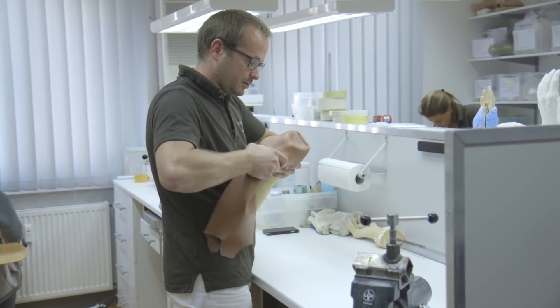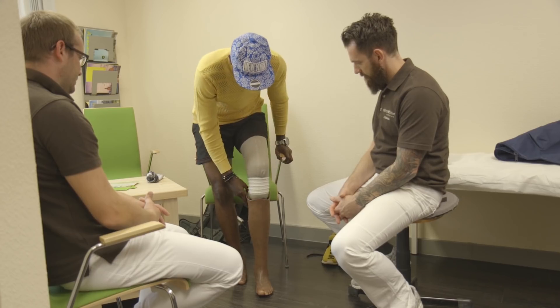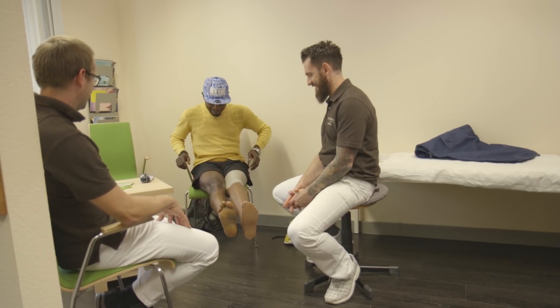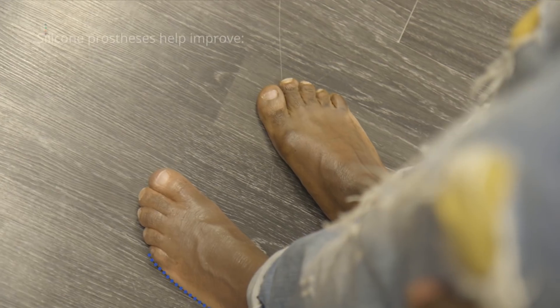So now we put on the cover for Samuel's prosthesis. It's not just used for the outer skin either — we use the silicone cover over the limb for comfort and to get a strong fit with suction alone. That's perfect. Can you see the difference?